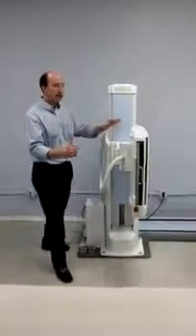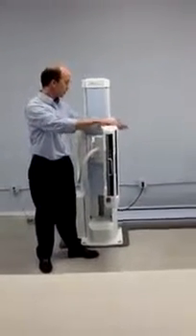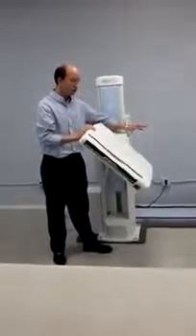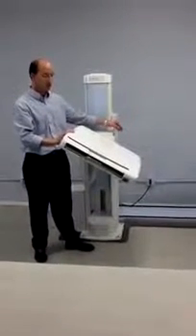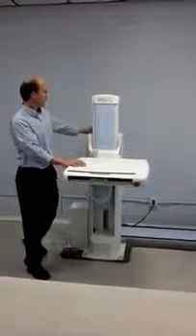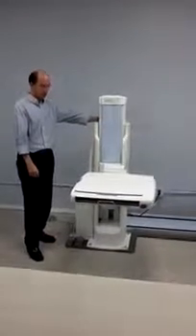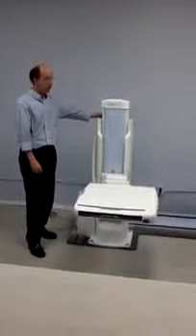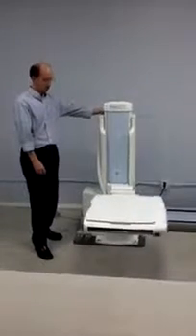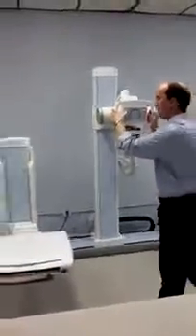Rotation of the image receptor is done by simply releasing a mechanical brake, which allows us to rotate the image receptor. There is a stop every 15 degrees. Here we are in the horizontal position and we are going to lower this down and bring our tube stand over as if we were doing table work.